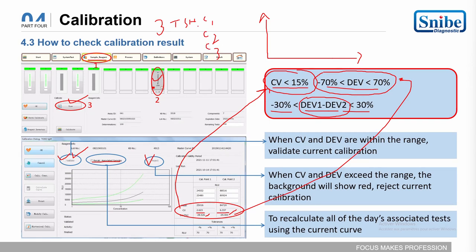According to his experience and the normal results, he thinks that these results are not good, and the reason is the calibration. So he decided to recalibrate the TSH reagent kit and to fix the problem.